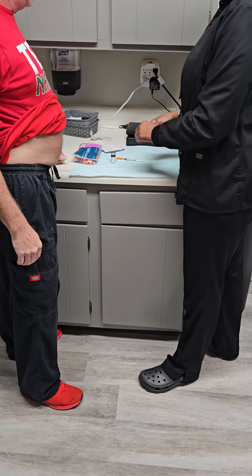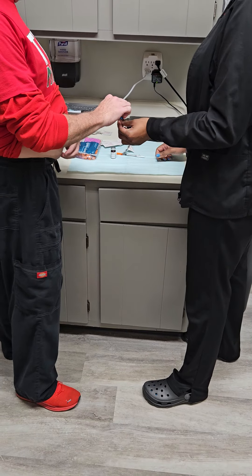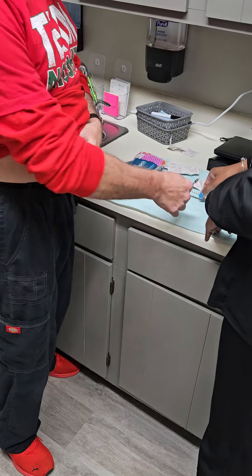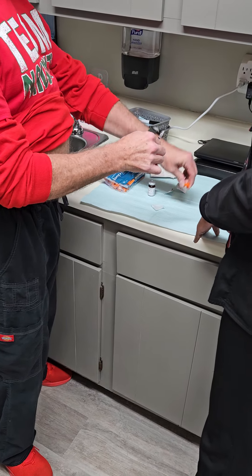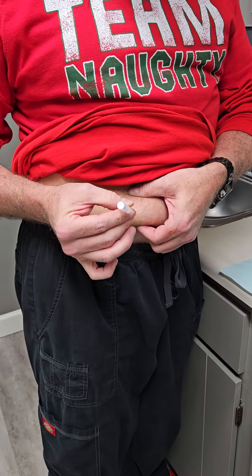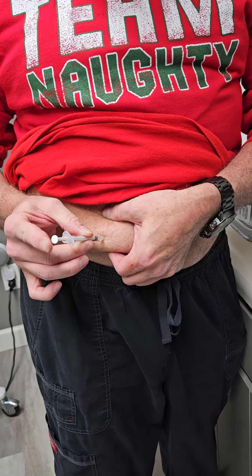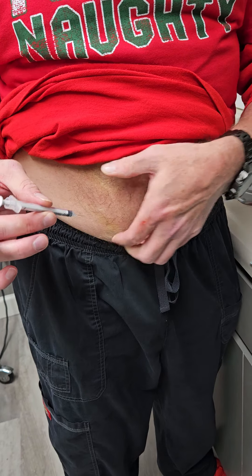Now we're ready to inject. We're going to get another clean alcohol prep pad and clean your surface. You're going to take your needle with your medication in it and uncap. You're going to pinch that skin where you're going to put the needle in, and you're going to inject slowly. Push the plunger in, pull your needle out, and recap that needle.